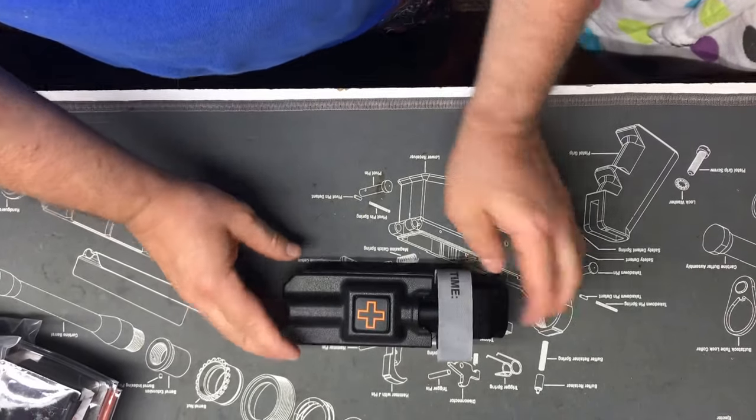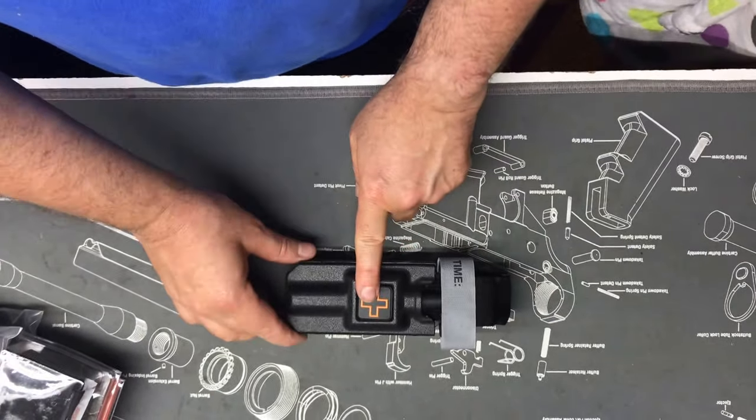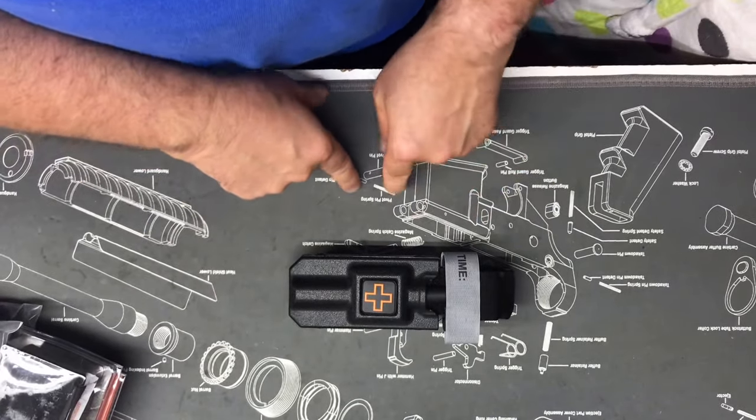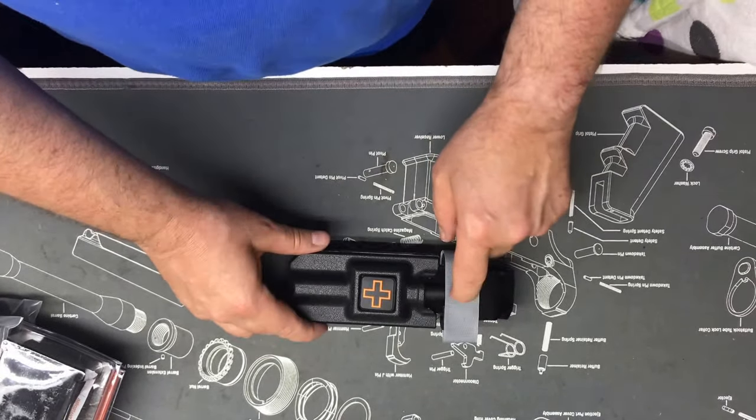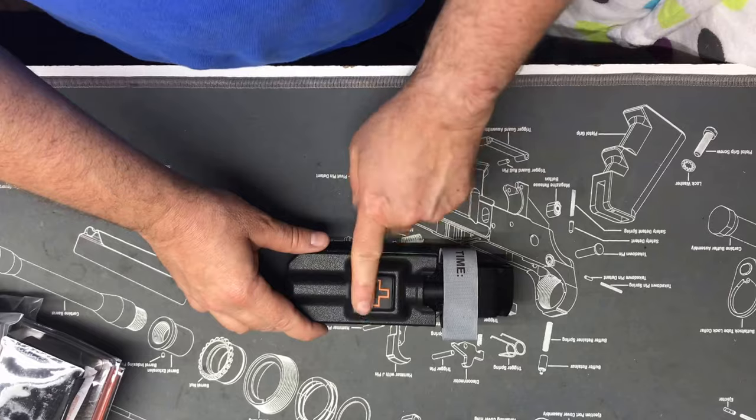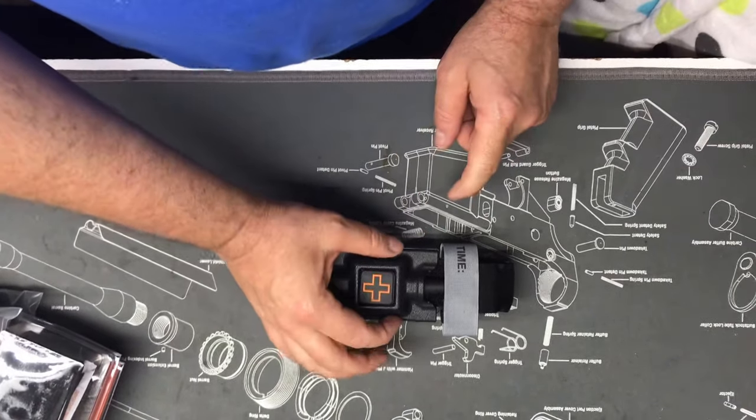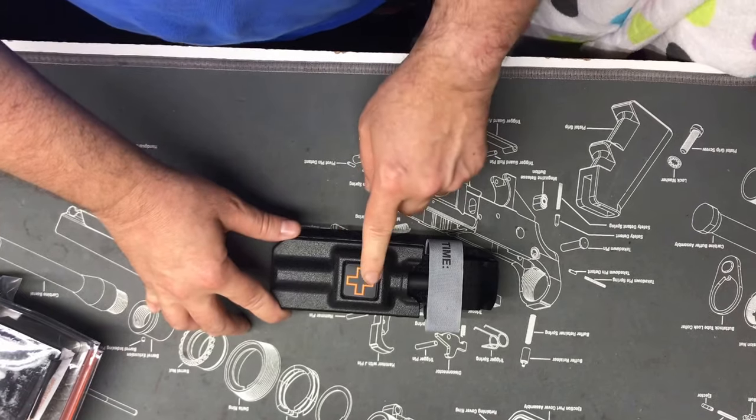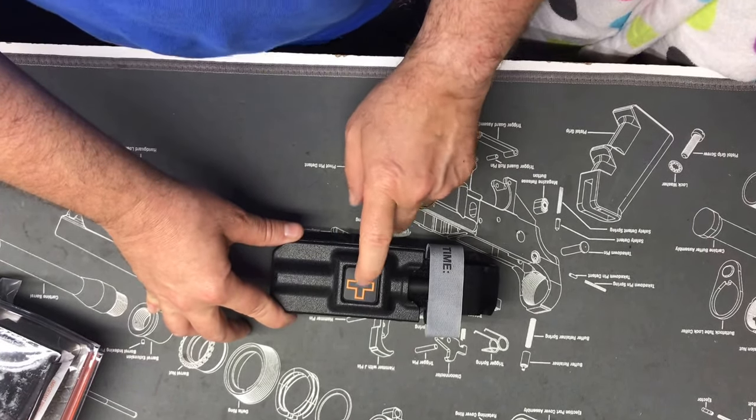Another issue that I have seen is the new Recon Medical tourniquets that look like the CAT tourniquets will not fit into these cases because the buckle on them is just a little bit too wide. So that information has been sent to Recon Medical and also to 1110.